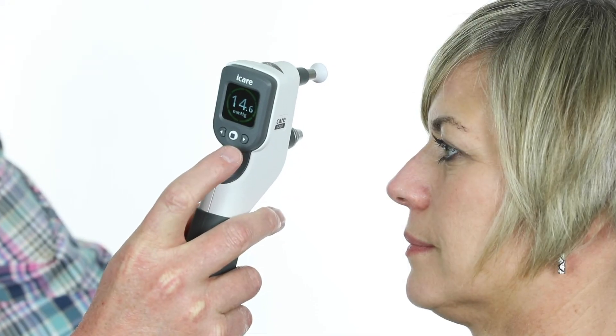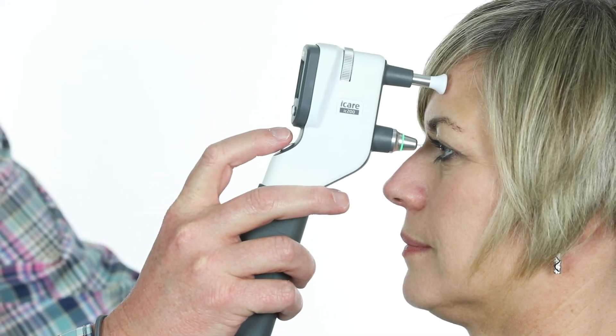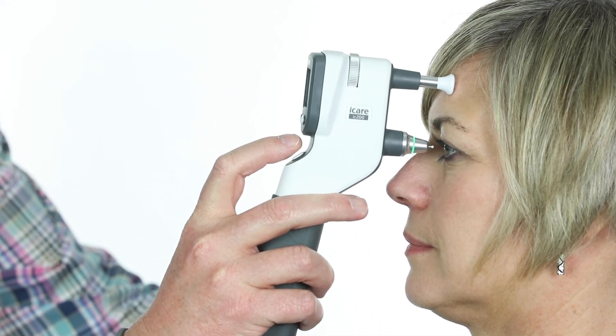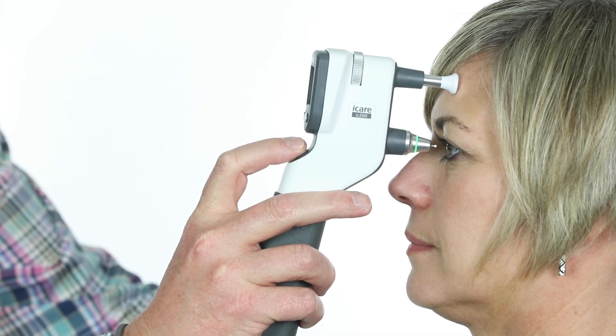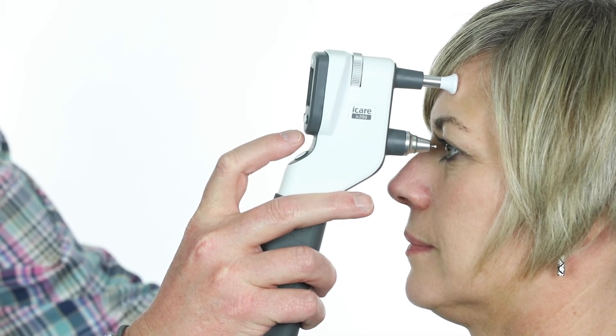Press the measure button once to clear the reading. To perform individual measurements, press the measure button lightly 6 separate times or until you hear a long beep.